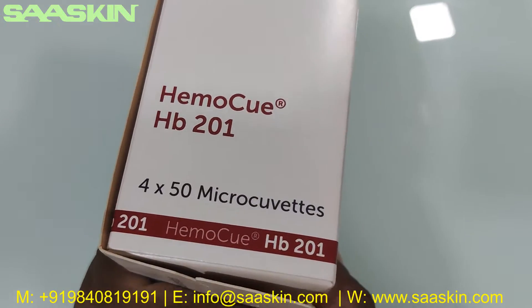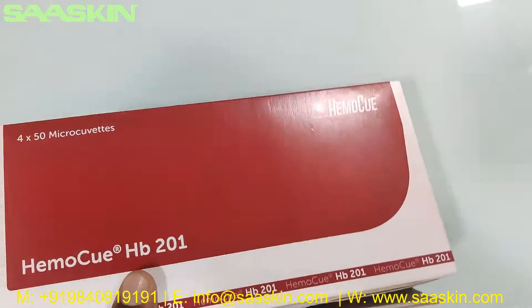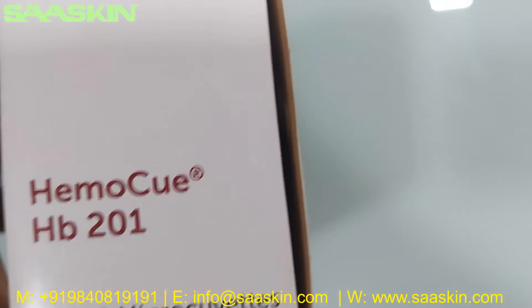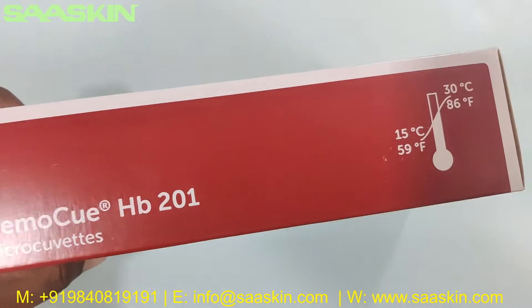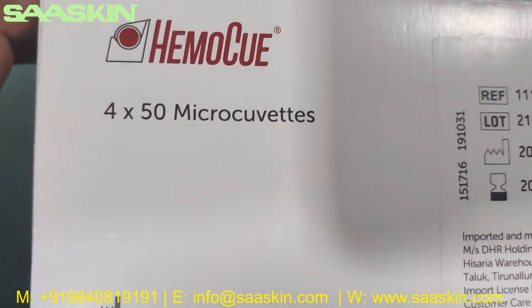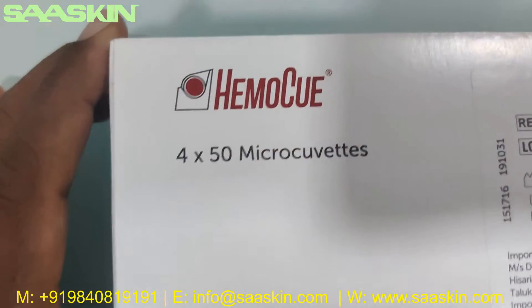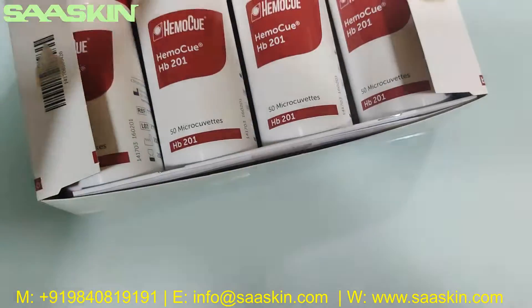You can see the back side of the box, and that's the other side. In a pack you get 200 micro cuvettes. Let me open this for you and unbox it.